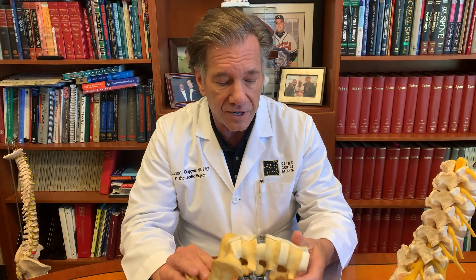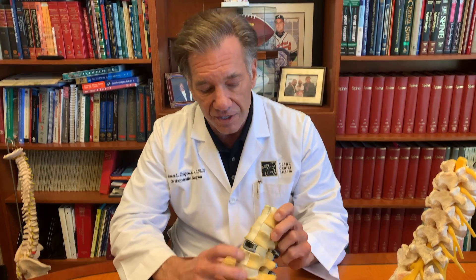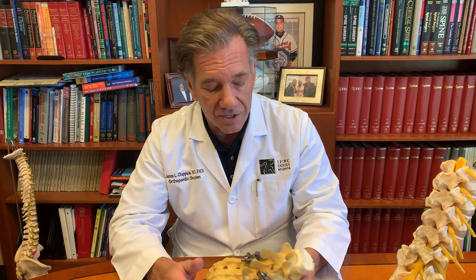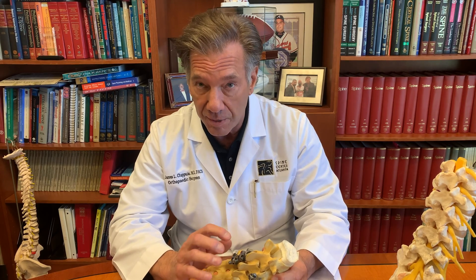The spine can be stabilized or fused in a lot of different ways. It can be done from the front, or anteriorly, and that would be known as an ALIF, or anterior lumbar interbody fusion. It could be done from the side — that's called a transsoas approach, where a device is placed interbody but done from the side. Many times those procedures are backed up with pedicle screws put on the back part of the spine to stabilize things.